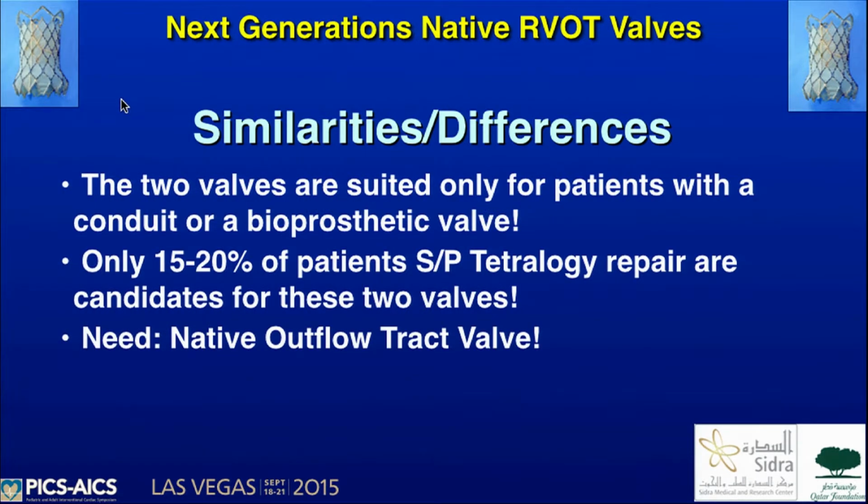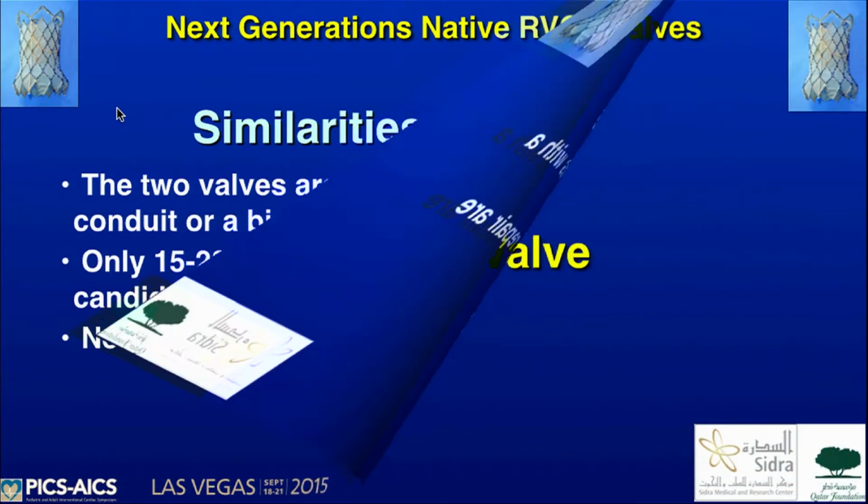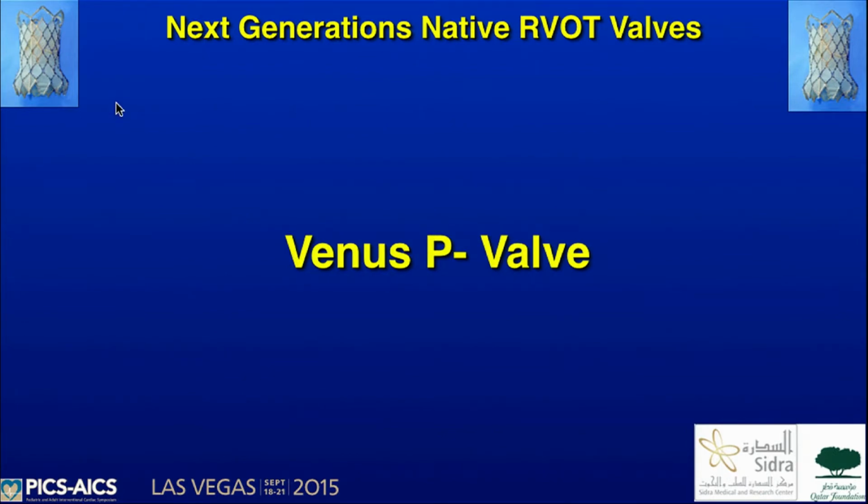However, both of them are suited primarily for patients with conduits or bioprosthetic valves, although we have seen some implantation in native outflow tract. The problem is that only 15 to 20% of the patients status post-tetralogy of Fallot repair are candidates for these two valves, and that leaves a large percentage of our patients with native outflow tract. There are few valves on the horizon.